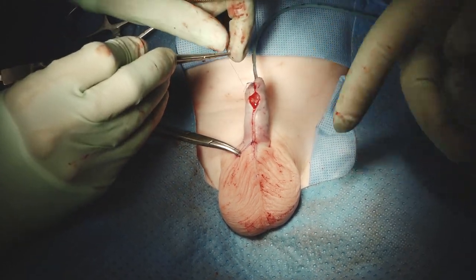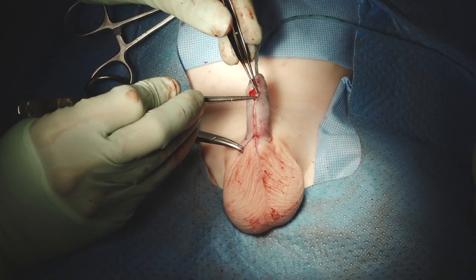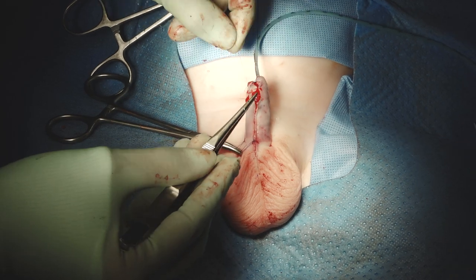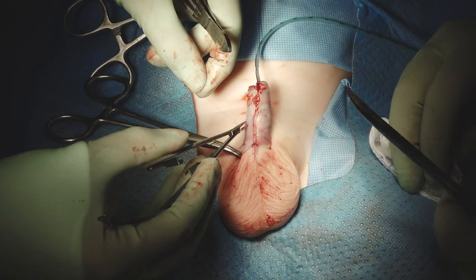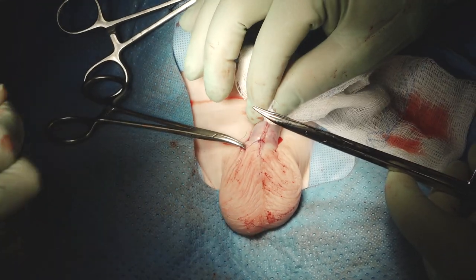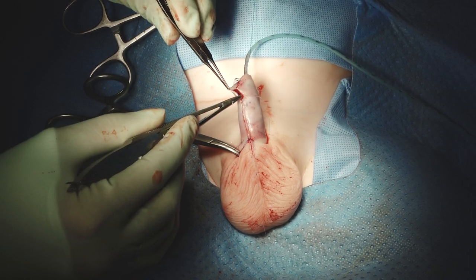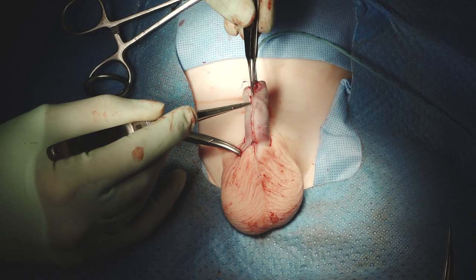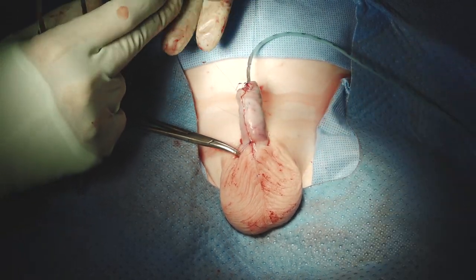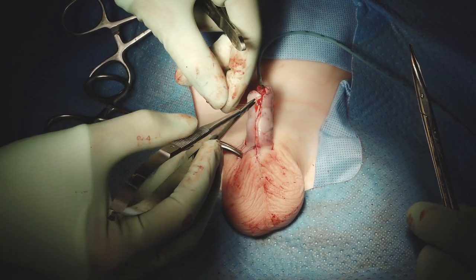Since you started doing these repairs from this direction, we haven't needed to do that dartos flap — I don't recall the last time we did that. Barry Kogan is the one who published it, and I've done it many times, but my eye wasn't seeing that part of that twist was creating a left skin deficiency, and you don't get rid of it unless you address specifically that deficiency. I got around it by making that flap, but there's another way to do it — you need to get this skin symmetrical so it takes care of both at the same time.